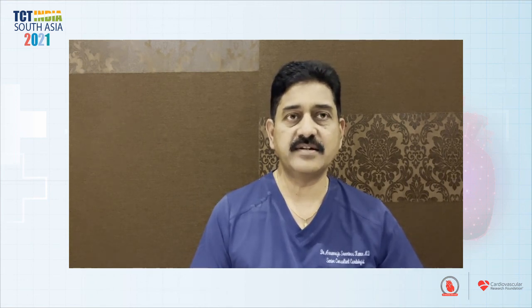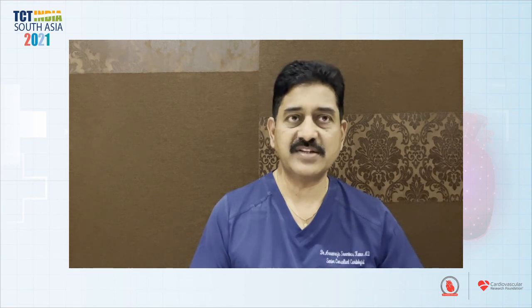Dr. Rajasekhar specifically mentioned that it should not be taken as jailing like balloons or wires. Sometimes the IVUS catheters could break. So it is not advisable to jail the IVUS catheter before the final stenting.